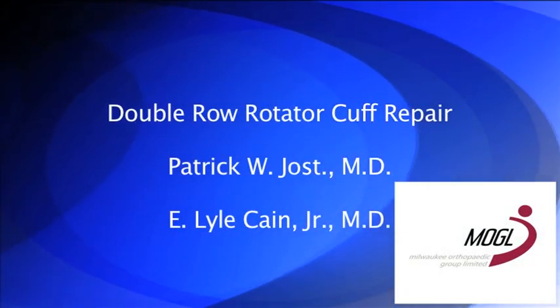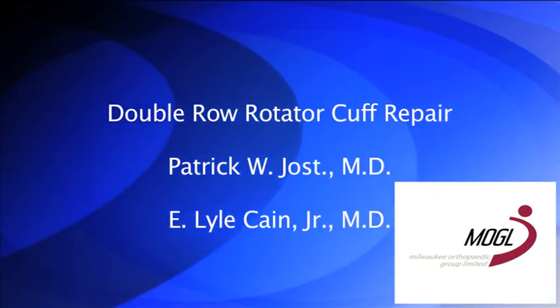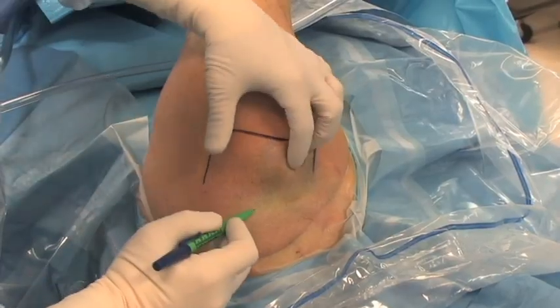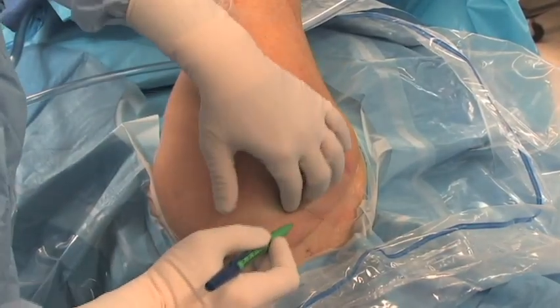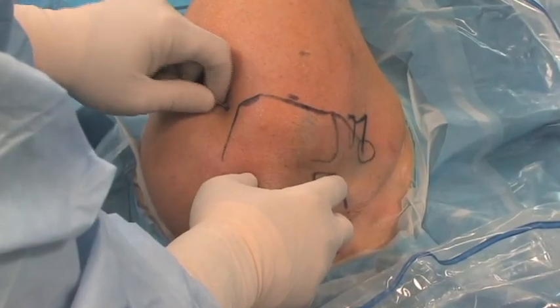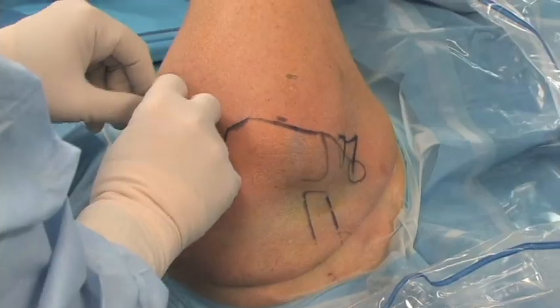This is our technique for double row rotator cuff repair by Lyle Kane and Patrick Yost. Bony landmarks and arthroscopic portals are marked with a marking pen. The posterior portal is 2 cm medial and 2 cm inferior to the posterolateral border of the acromion.